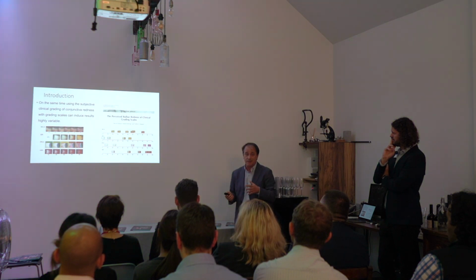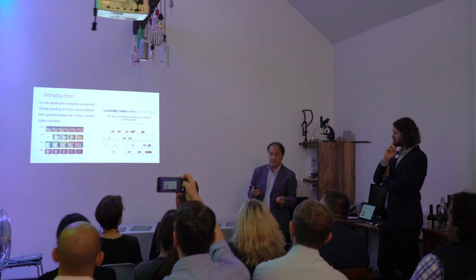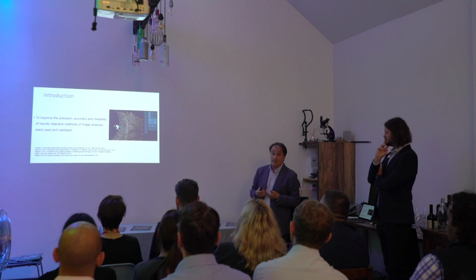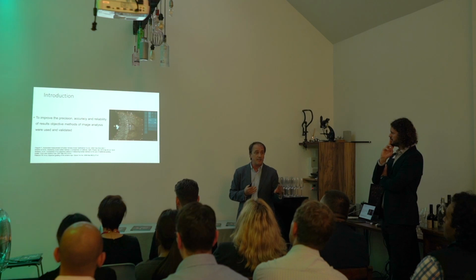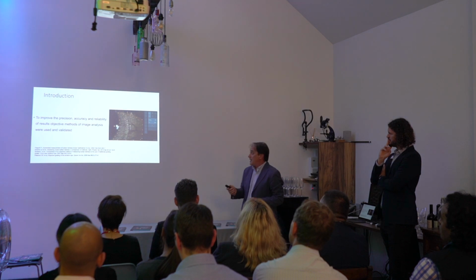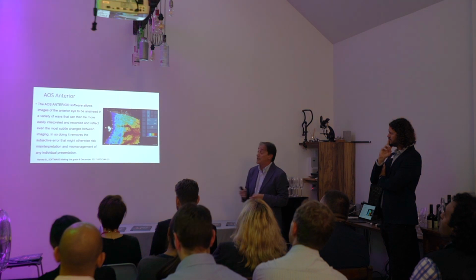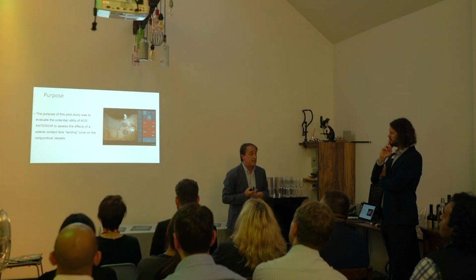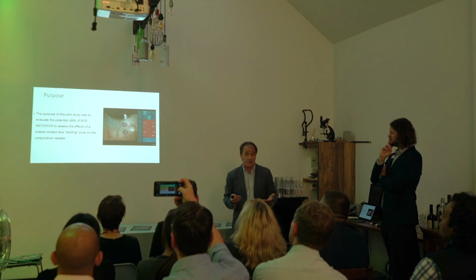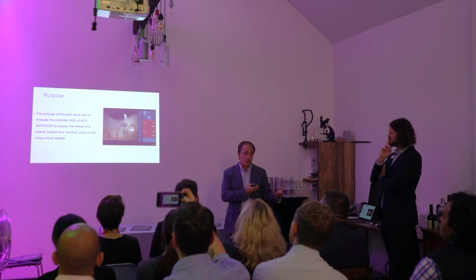And for this reason, it's important, when we have something to measure, to have something more objective. And these are the results obtained in different papers on the evaluation of the anterior segment using objective software. And this was our idea: to use AOS anterior to evaluate what happens when we fit scleral lenses, to obtain more information and to compare with the objective approach on this topic.